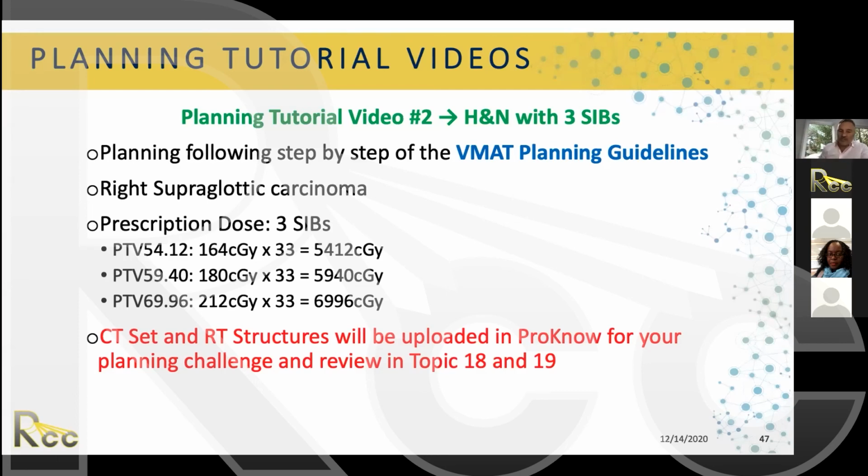Probably not so much in the next topic 18 because I have more things to present. But if we have time, and if someone did it, we can start going with the presentation, but definitely in the session of topic 19, which is on January 5th. Then these are the 2 videos, video number 1 and video number 2, for pelvis and head and neck, that we did following exactly this method that we explained to you, which is very good.